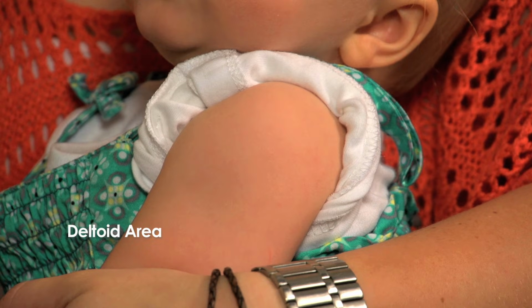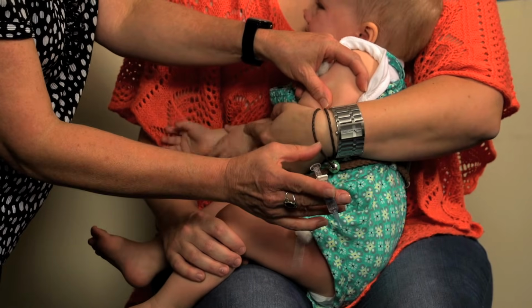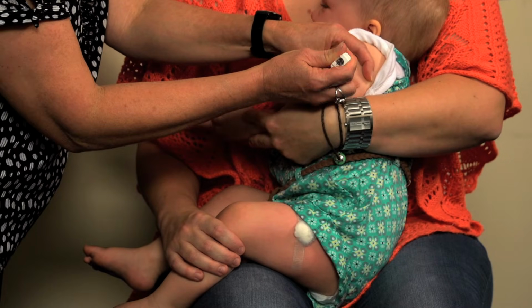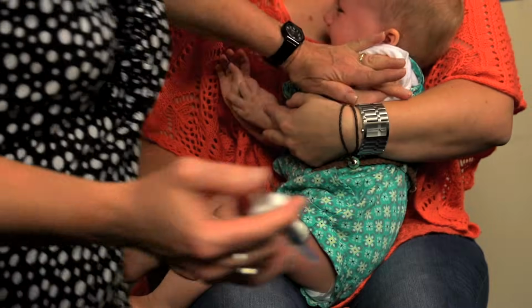The injection site for the deltoid area is halfway between the shoulder tip and the muscle insertion at the middle of the humerus. Draw an imaginary inverted triangle below the shoulder tip using the identified anatomical markers. The site for injection is the middle of this triangle. A single injection can be given into each deltoid muscle using the same technique as previously seen. Note how the nurse pauses to ensure the child is secure and not moving before she inserts the needle.